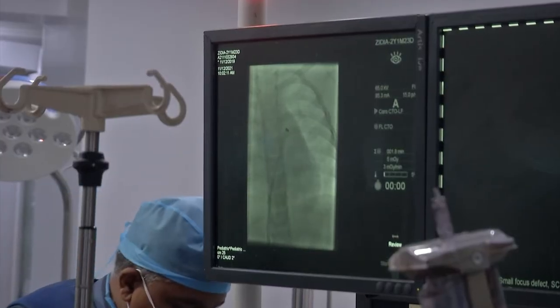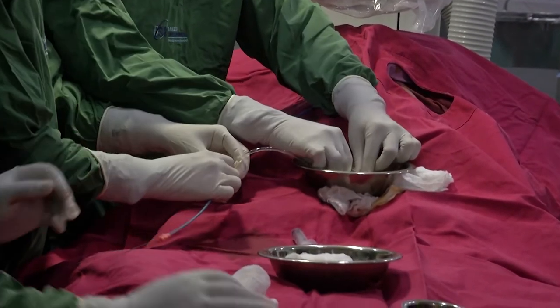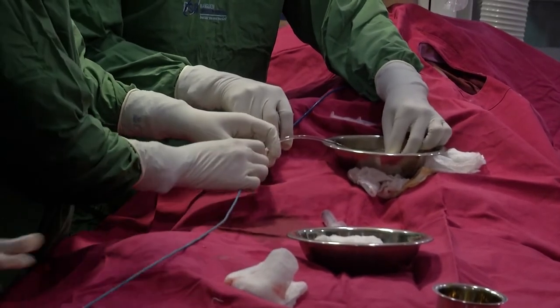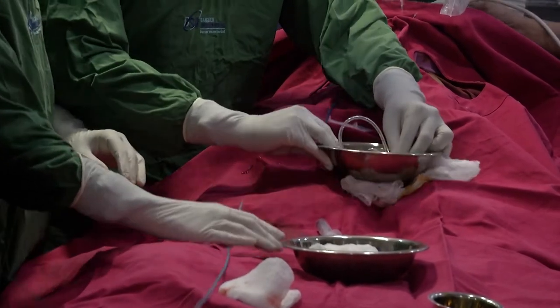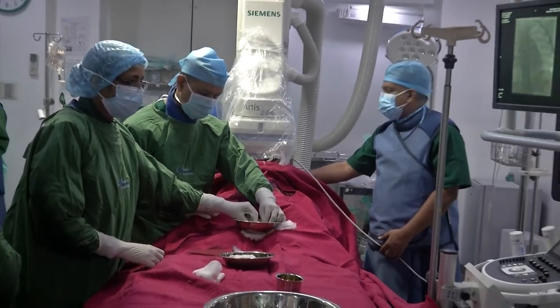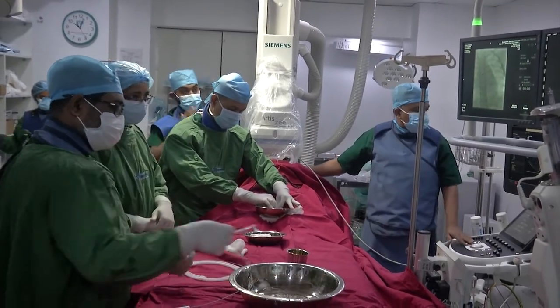You have seen I have applied some tweaks here, because we are almost closing the wire, and the wire was in the left atrial appendage. If you enter the left atrial appendage with the delivery system, there is chance of complication. The left atrial appendage is the commonest site for rupture and then complication. So you have to be careful beforehand and take appropriate measures to avoid complication. We have applied some things, and we are now inside the left atrium with the delivery system.